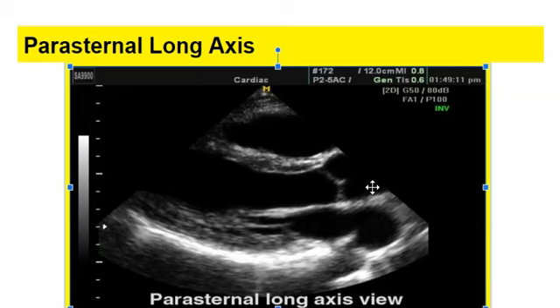When you do a general ultrasound on a patient, you're oriented to the body and what's on the right, what's on the left. The heart's different. The heart sits in the body differently. So the index marker corresponds in cardiac sonography completely opposite to how it does in general ultrasound. Now just remember that. So here we are in the parasternal long axis view. We all know how to get this by now.